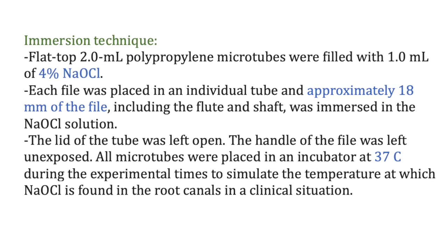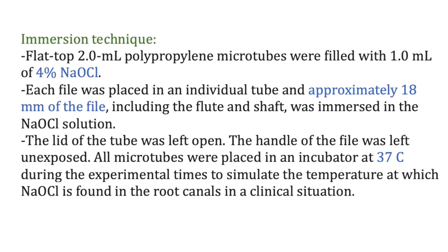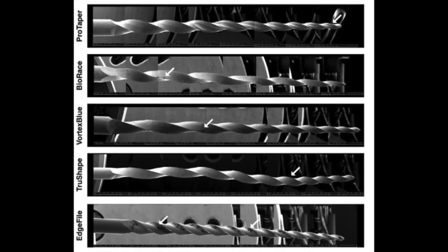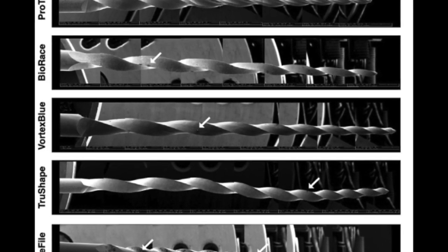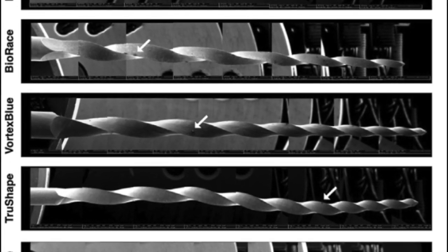Inspection of the instruments was done at every time interval using the naked eye, and only selected files were chosen to be inspected under scanning electron microscopy. Screening of the 6 unused brand new files from each group under SEM inspection showed that no single file system was completely free of defects or debris. Pitting was the most common defect of unused files and was evident from the cutting head to the end of the cutting surface. All Edge File X7 showed black residue on the surface of the working portion of the file.